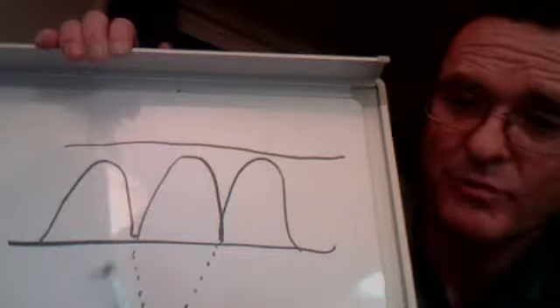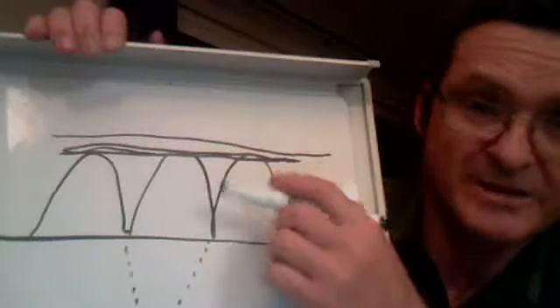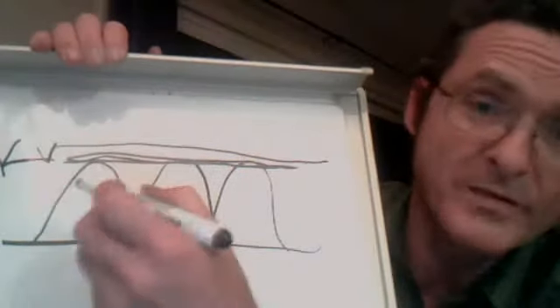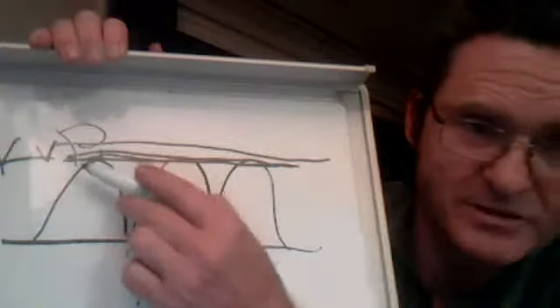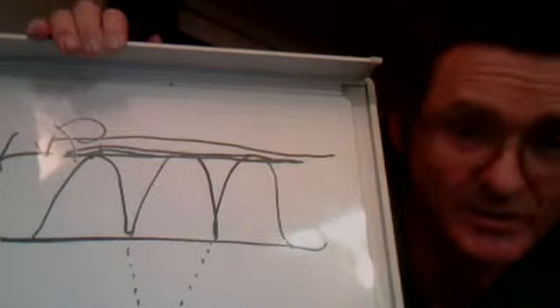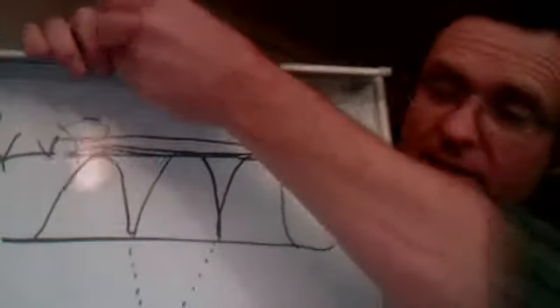Now, some of the things that are important to your X-ray machine is the actual peak voltage, which is going to be called your kVp, and that stands for kilovolt peak. Your kilovolt stands for nothing more than 1,000 volts. And your kilovolt peak is going to be the very top of the wave that it's going to use here. Most dental x-ray machines run between 60 kVp and 90 kVp, which would actually be between 60,000 and 90,000 volts. Now, they actually use very little current to generate the x-rays.